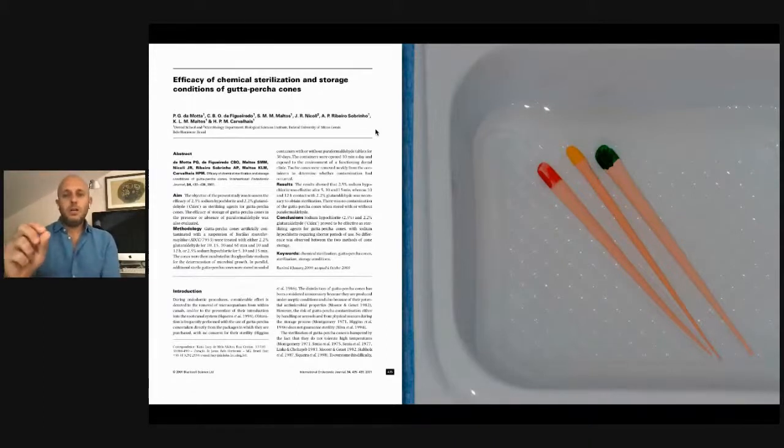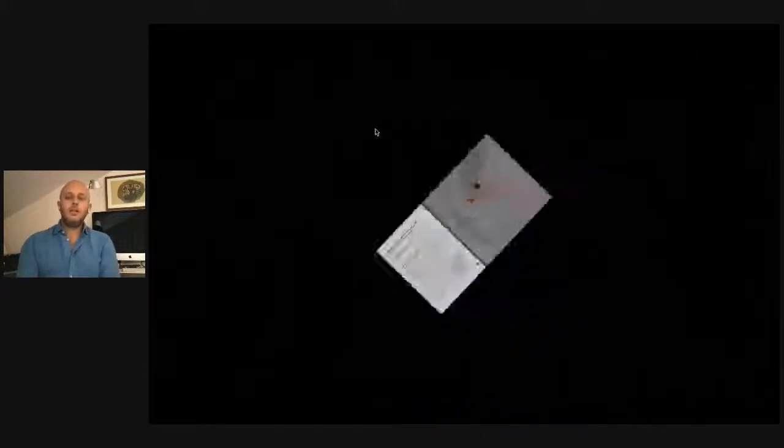How? Put some drops of sodium hypochlorite inside a plate and put the master cones inside the hypochlorite for a few seconds while you are drying. In the meantime, you will dry the canals and you are ready to use that disinfected points to seal the canals.